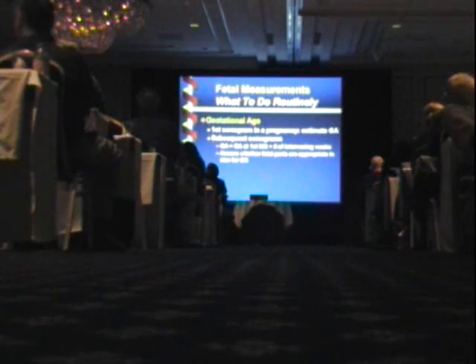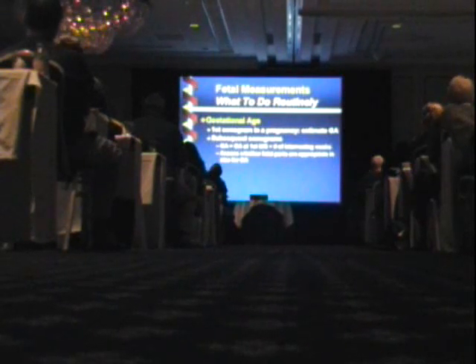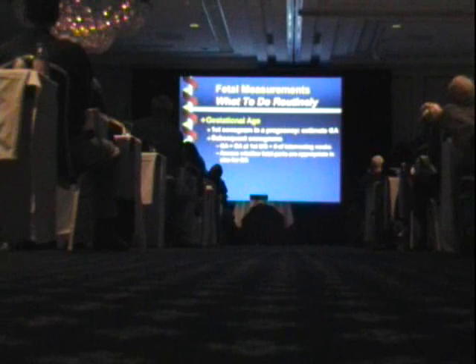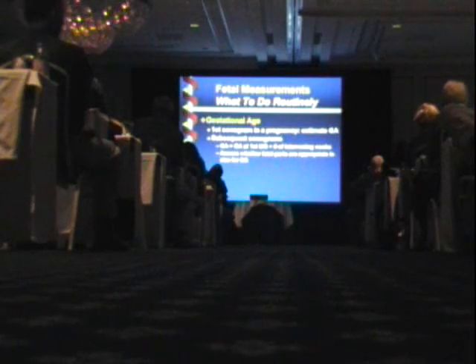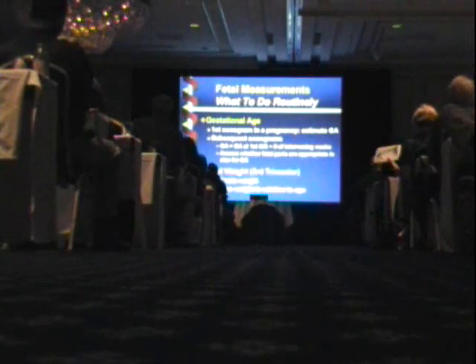Because ultrasound gets less and less accurate for predicting age or assigning age, your best estimate is always based on the earliest ultrasound. At the time of that second ultrasound, where you've dated her already at 25 weeks before you even took a measurement, you want to make sure the baby is appropriate in size for 25 weeks. If it isn't, don't change the age. Get worried about the baby if it's, for example, too small for dates.